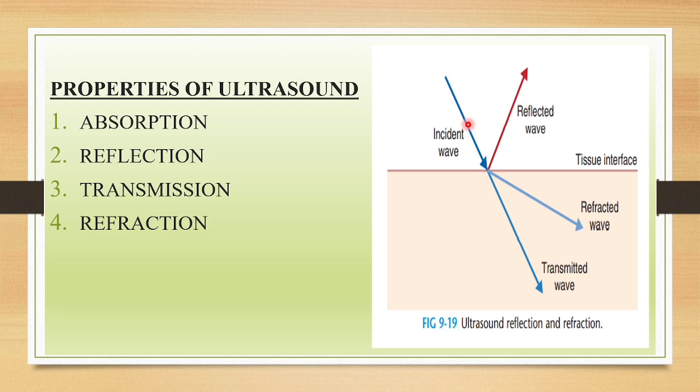During the application of ultrasound, we need to maintain direct contact between the skin and the ultrasonic head, and keep moving in a circular or other manner. We can use either transverse strokes or direct circulars, and like that we can use a figure of 8 and all. This is the incident wave, and this is the reflected wave. This is known as reflection.